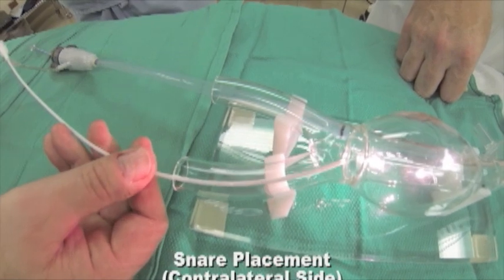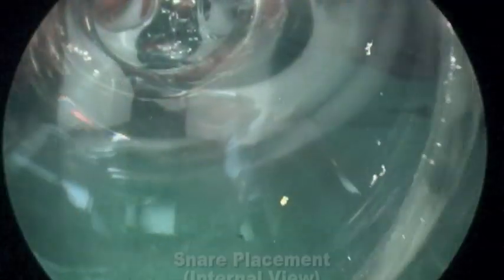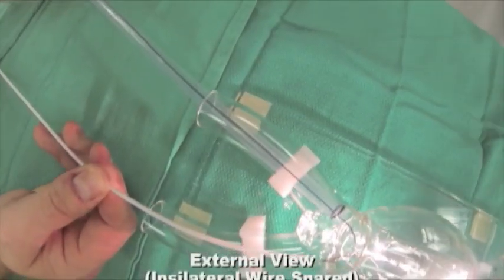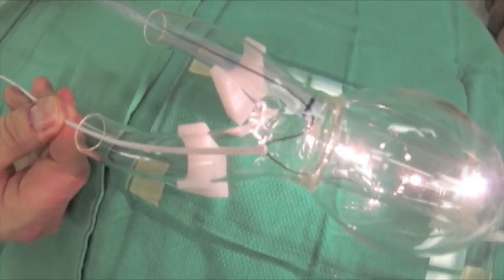Then on the contralateral side, a sheath is placed and the snare is deployed. Here you can see the internal view of that. A wire is then placed on the ipsilateral side. The snare on the contralateral side grabs the wire and pulls it through the incision on the contralateral side. Here you see an external view of exactly the same thing.